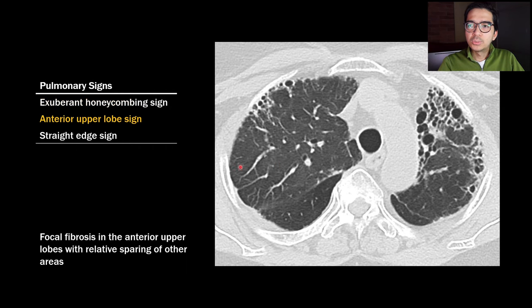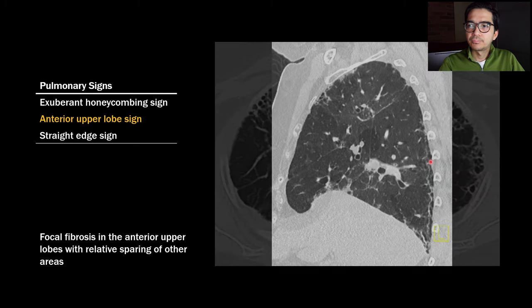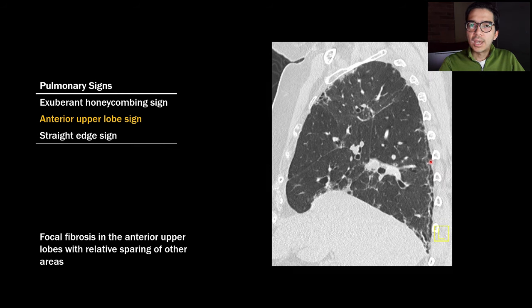The anterior upper lobe sign is when you have focal fibrosis in the anterior upper lobes with relative sparing of the other portions of the upper lobes. It's often helpful to look at the sagittal images, where you'll see basilar and peripheral fibrosis in the lower lobes as well as anterior subpleural fibrosis in the upper lobes.